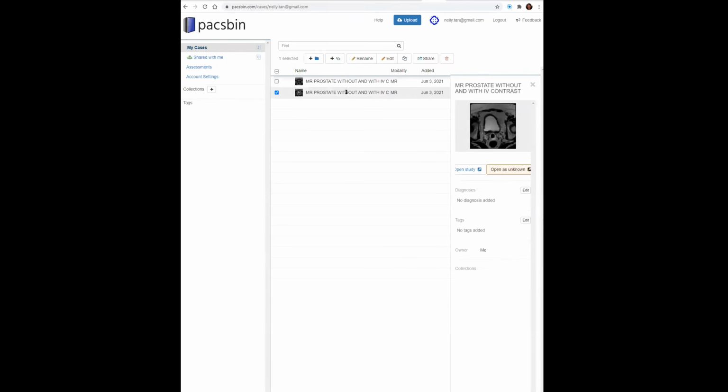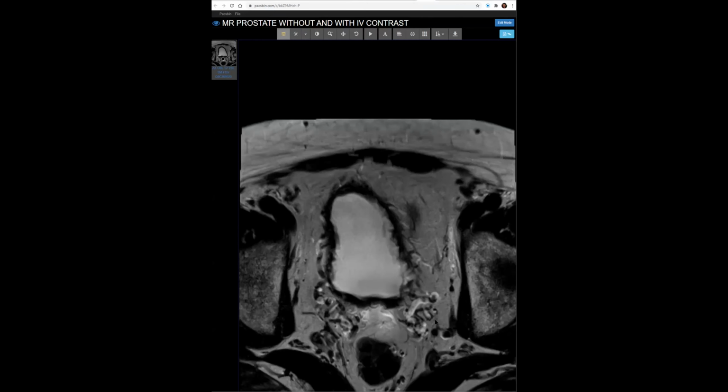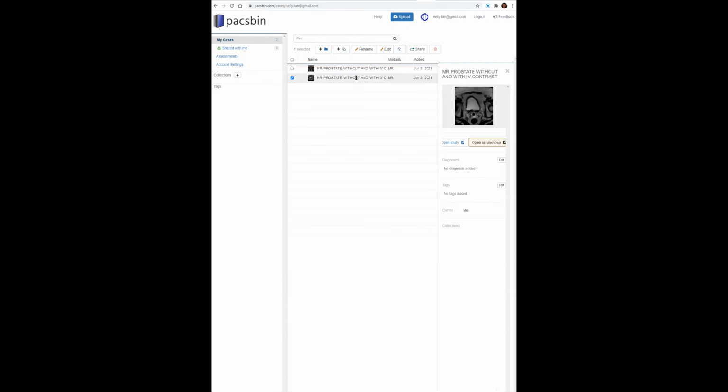I wanted to try to create an MR curriculum for our residents when they come on abdominal radiology. And part of it is showing cases, right? And we don't have a good way right now to have a repository for great cases. So then I started looking into an alternative, and I found this PacsBin. I saw it again during AUR, and others are using it.